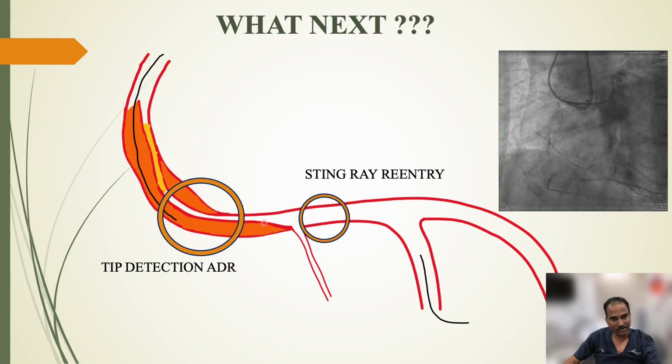So the next option is one with which you can overcome the other two problems. You can preserve this branch, and you can also minimize subintimal stenting by going retrograde. Since this CTO is not long, you can just go retrograde, as there was a good interventional collateral, and cross from true to true if possible, or you can even do a reverse CART here and complete the procedure. So this was the best option among the three available options.